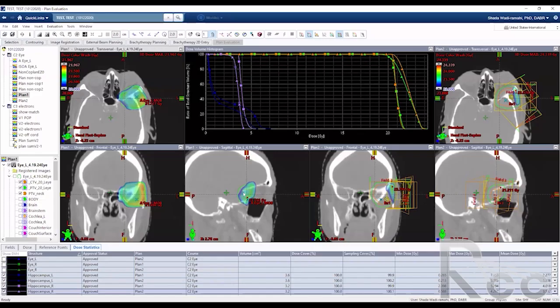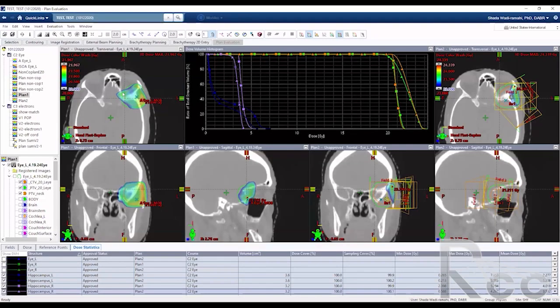So I hope this shows the benefit of not being focused on just 95% coverage, 95% dose, or whatever different numbers you like to look at, but also how uniform your prescription dose is here, and how much of it is going to normal tissue. Like this is honestly not acceptable. And then the continuous coverage versus this guy. And yes, the hotspot is too much. 120% is too much. And so what we can do is play with the wedges, add field in field.